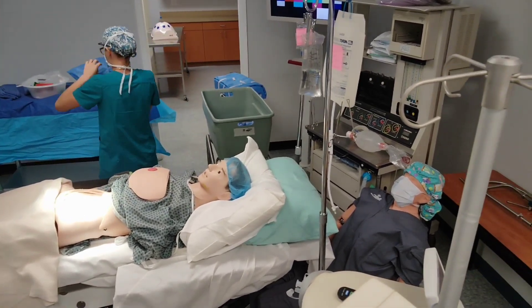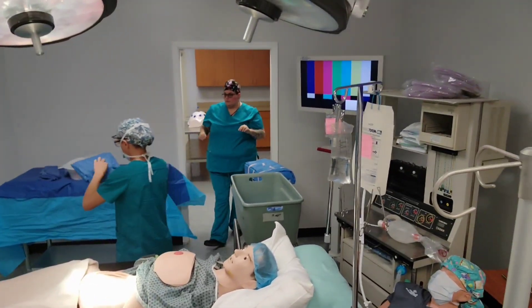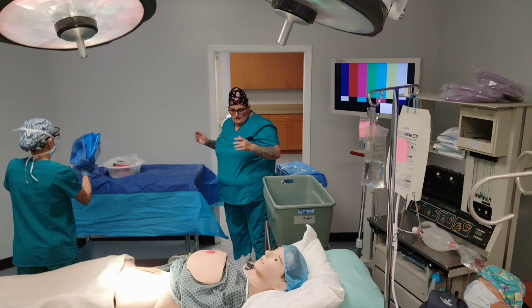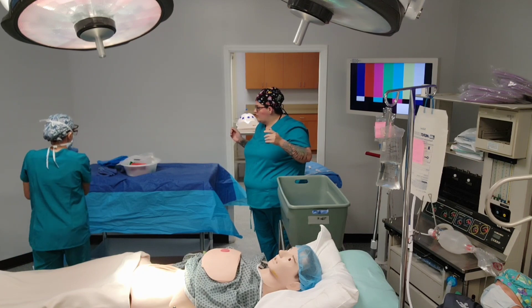You know what, I don't see one — I might need one. Sarah, I want you to get to that field as soon as you can. What I want you to do is establish what needs to be open, what came open. Get that drape open. Get that open up. Get to that field as well. Awesome, right now.